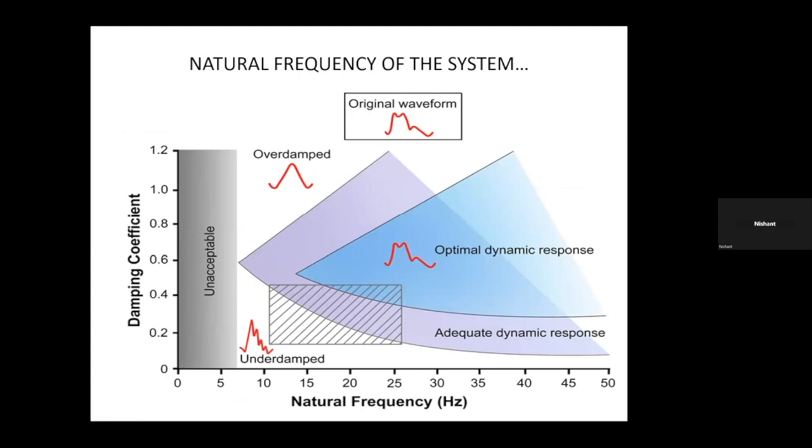So coming to the physical principles of our monitoring, there are three principles to optimize so that the arterial pressure waveform which we record should be reliable. These are natural frequency, damping coefficient, and dynamic response of the system. The natural frequency should always be more than the normal frequency of the arterial waveform so that the arterial blood pressure which we record is reliable.